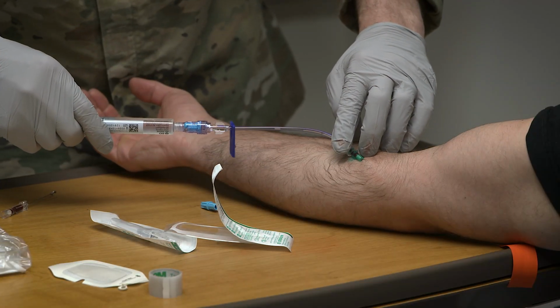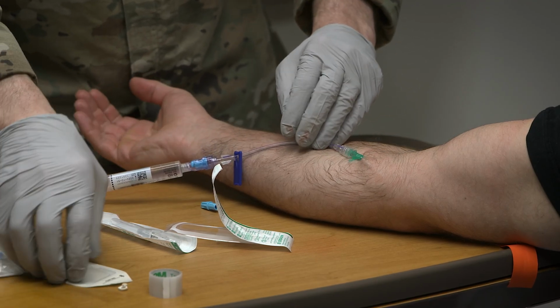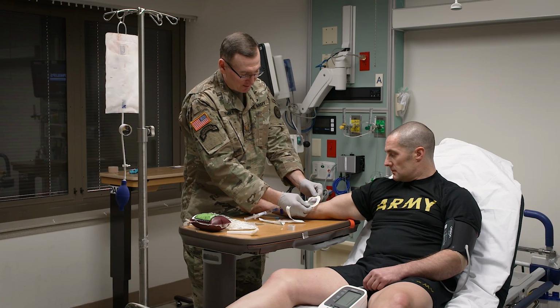Go ahead and make sure that you got good flow, backflow. I see blood there. Go ahead and flush it. And then you can go ahead and secure it with any means possible, whatever works best for you. There's no specific best way to do it.